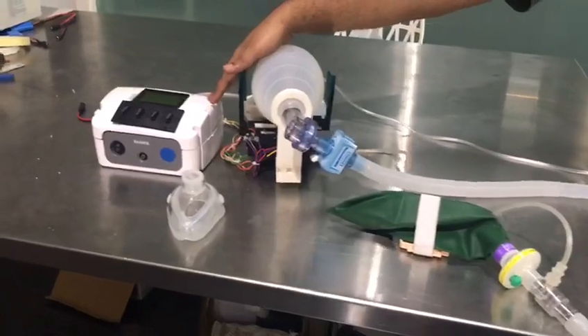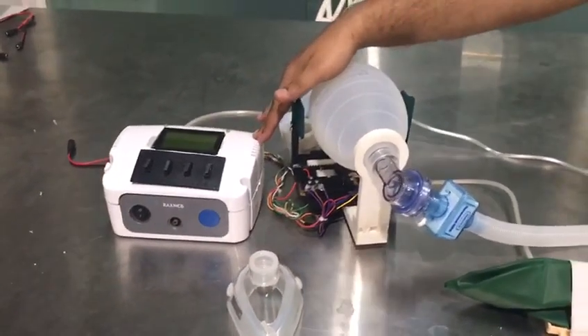This is the control unit where the IE ratio, tidal volume, and the oscillation rate can be adjusted.